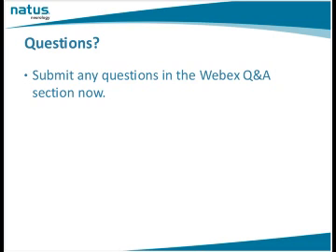The PCA is the only artery in the circle of Willis that perfuses the visual cortex. It's the only artery that will respond to light stimulation. So because it's perfusing the visual cortex, when we turn on the light, that's that actual artery providing more flow. That's called metabolic autoregulation. So no, you don't have to worry that it's stealing from any other vessels. No other vessel will ever react to light other than the PCA.